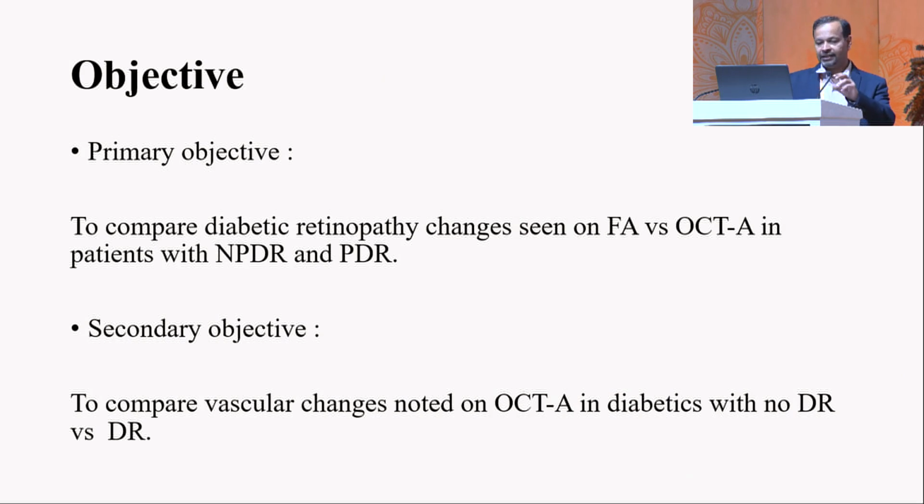Now, rather than talking just from the literature, what I would like to share with you is a study we did at our center some time back. It was the thesis work of one of our candidates, Dr. Nawazish. She is now faculty with us. This study planned to compare diabetic retinopathy changes as we see them on fundus fluorescein angiography versus what we see on OCT angiography. We also tried to see if there were any differences on OCTA between eyes that had diabetic retinopathy clinically and the eyes that did not.